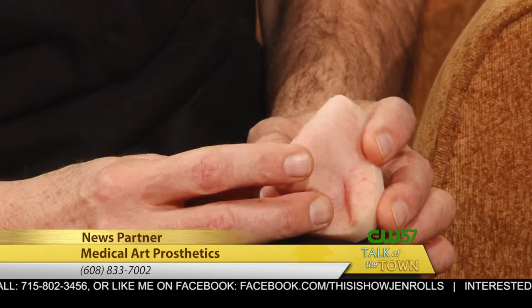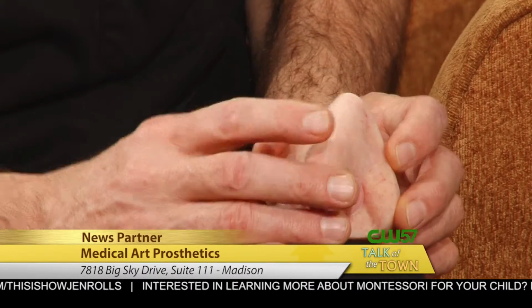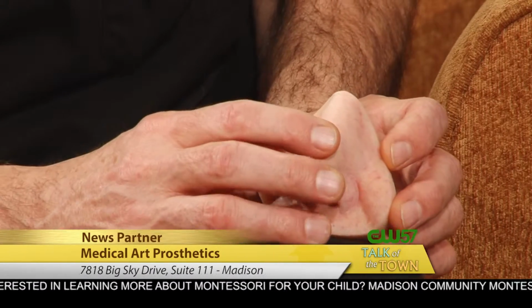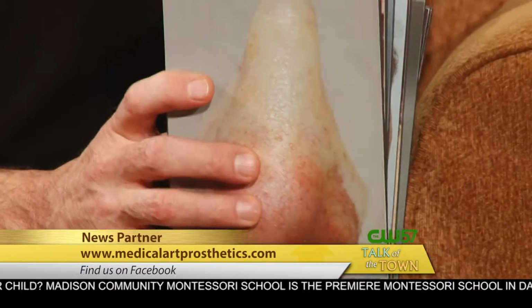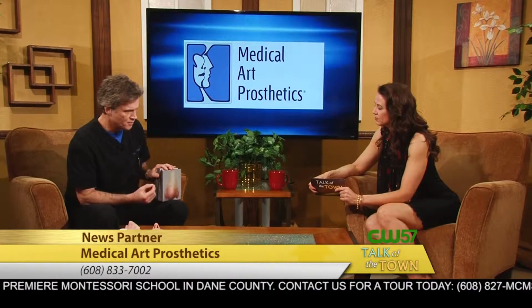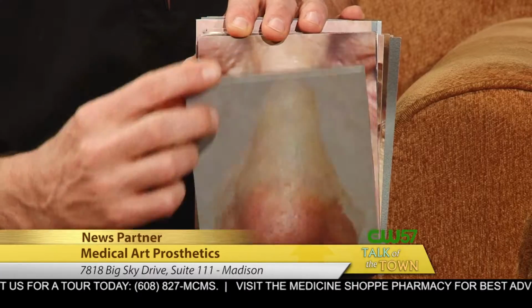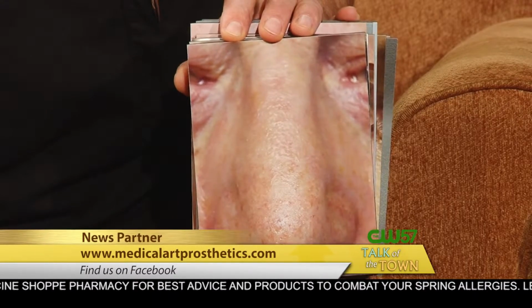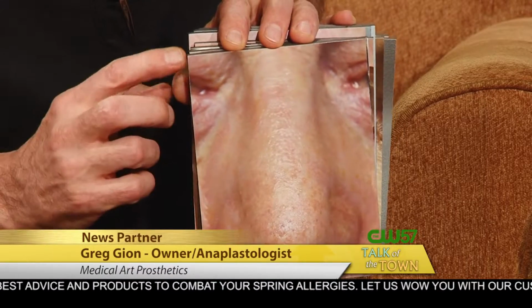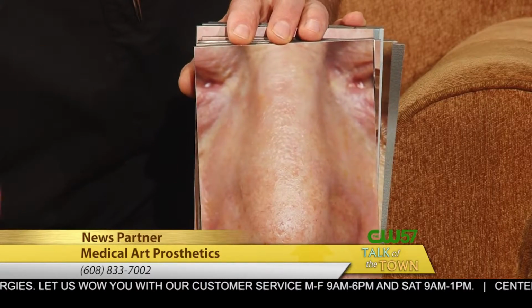And how is it attaching there? In this particular case, I've put a magnet in here just to make the model stay in place. But there's basically three main methods of attaching a prosthesis, and I've got some photographs. I'll move rather quickly through these, but they do illustrate the basic methods. Maybe the most common method is still adhesive, where someone would just apply an adhesive to the back of their prosthesis and then put it in place. Now it's in place, and you can get an idea of what that would look like. That's something you would put on and off every day with that adhesive. Exactly, and then they'd clean the adhesive off and reapply it each day.